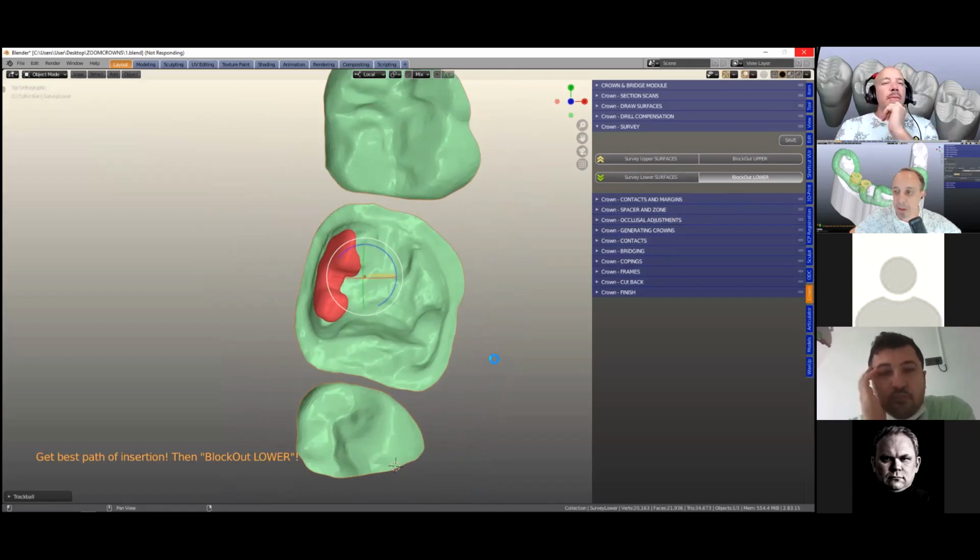You still with me? Yeah, Michael, Wolf? Can you just explain why we're blocking out those blobs that you put on for extra space?